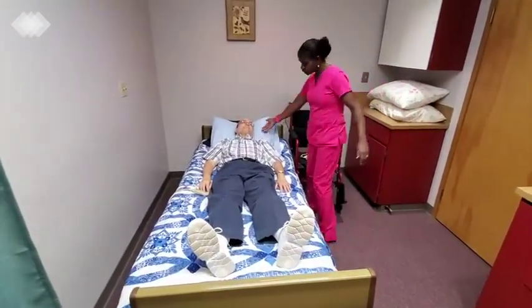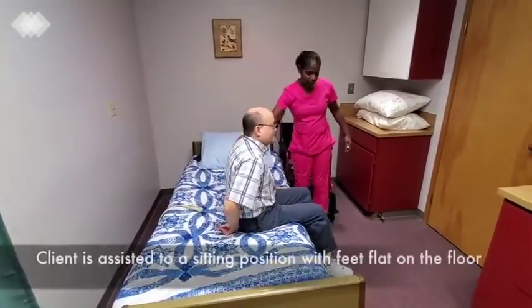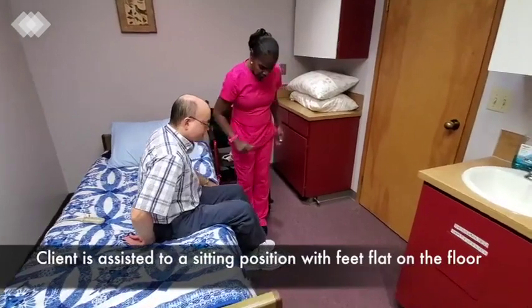So now I'd like for you to sit on the side of your bed. One, two, three — I'll assist you. I can see that your feet are flat on the floor.